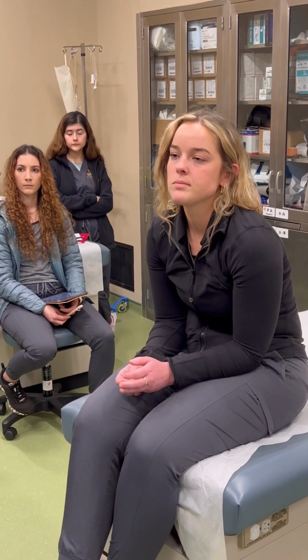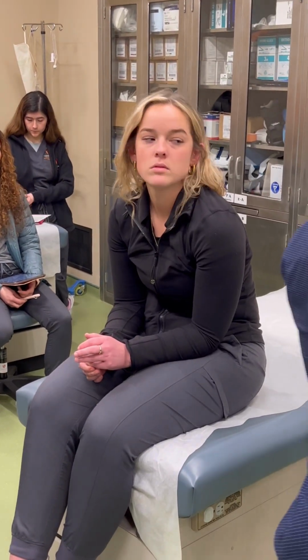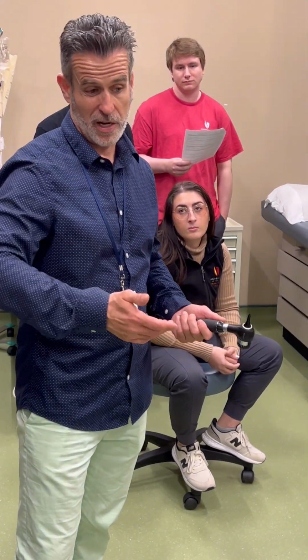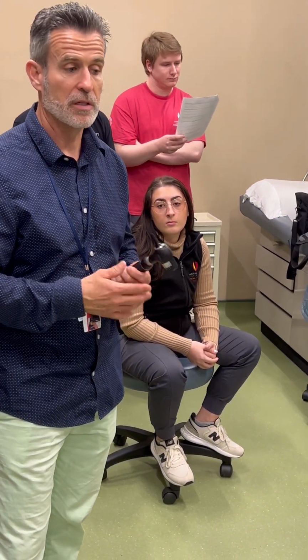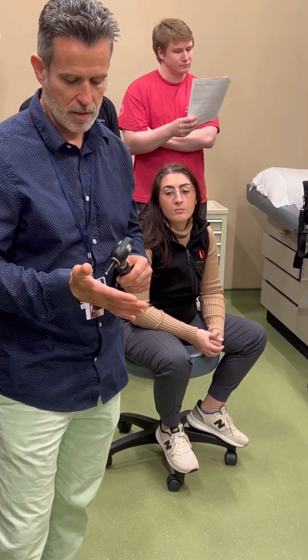Okay, the otoscope, use appropriate size for patient. So they got the adult one. So this is the 4.2, the 2.7 is for the kids. If a kid's 3 or 4 years old, like Jet, when I look at his at home, I use the big one. But at 12 months, 2 years old, you're probably going to use a 2.7. Okay? Pulls auricle upward and outward to straighten ear canal.